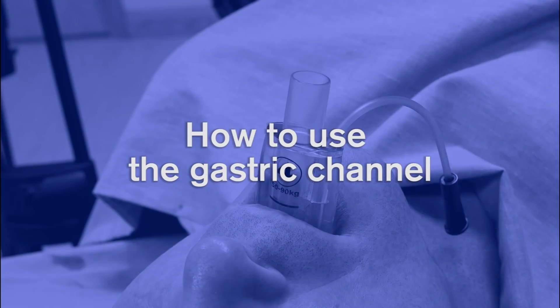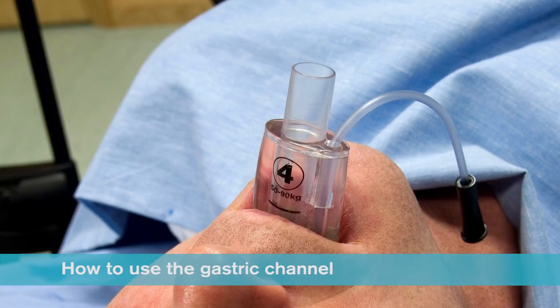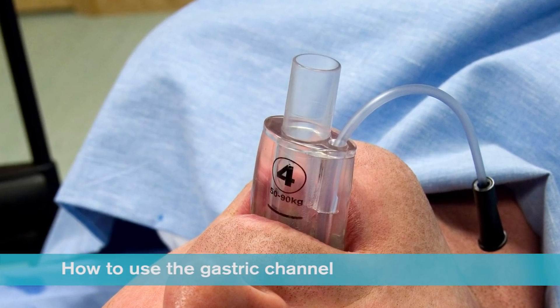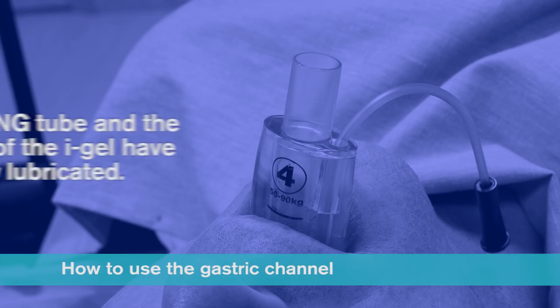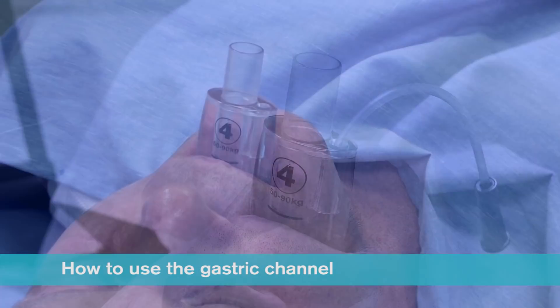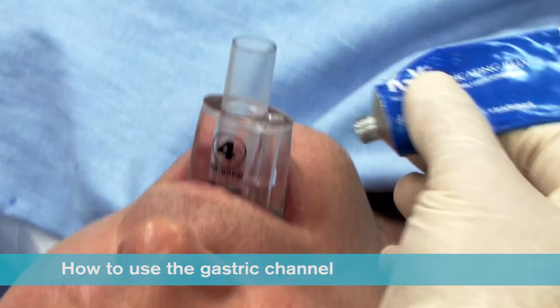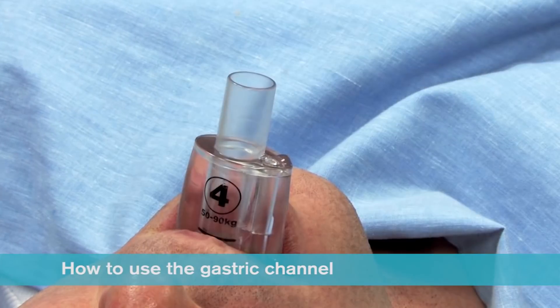How to use the gastric channel. If required, a nasogastric tube can be inserted down the gastric channel of the iGel. For a quick and efficient insertion, it is important that the nasogastric tube and the gastric channel of the iGel have been adequately lubricated before insertion is attempted. The ideal way to achieve this is to place a small bolus of lubricant over the proximal end of the gastric channel.